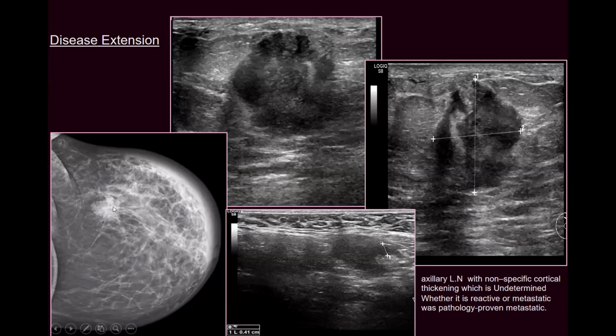Can you see the lesion here? And look at the edema extending here. Although the lesion looks unifocal, the amount of edema is much larger than the lesion itself, including the lateral aspect of the breast and extending to the nipple areolar complex.